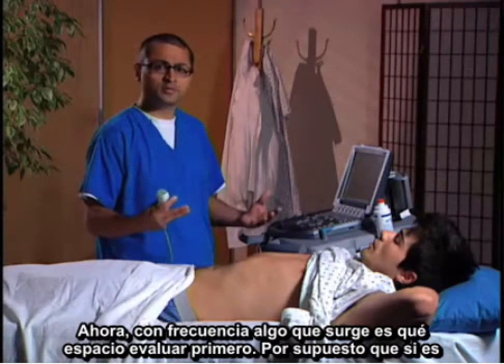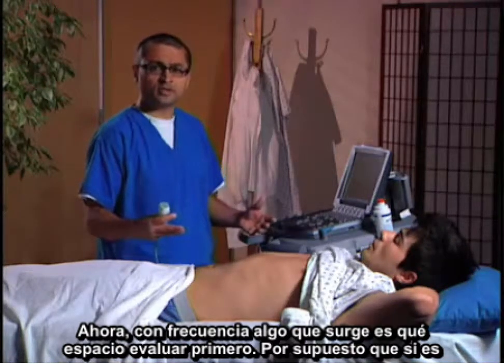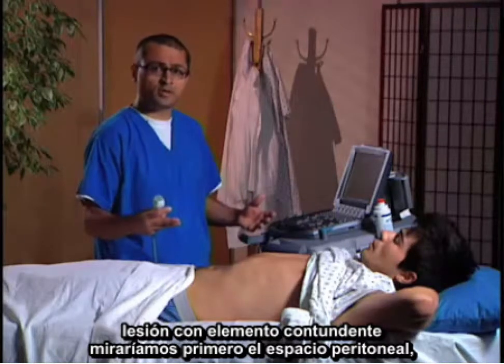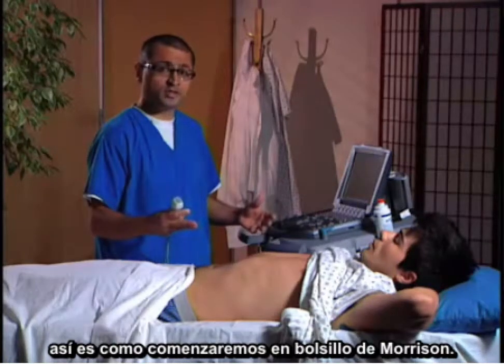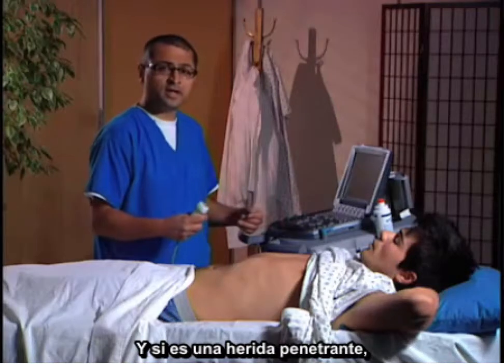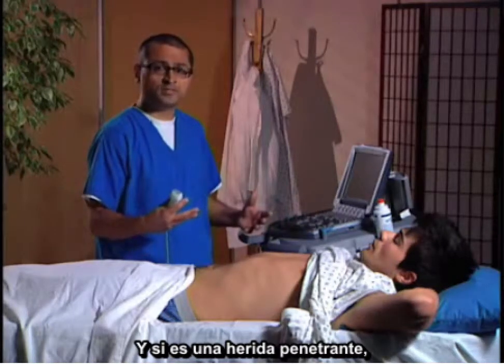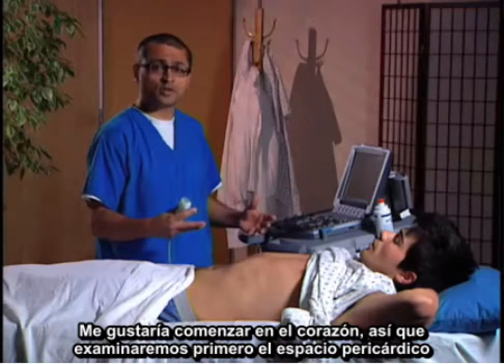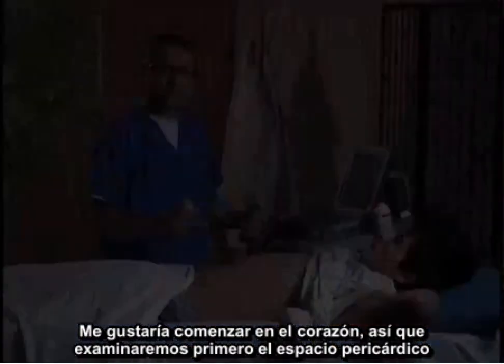Often the question comes up: which space to evaluate first? For blunt trauma, we're going to look at the peritoneal space first, starting at Morrison's pouch. For penetrating injury, I like to start with the heart first, so we'll examine the pericardial space first.